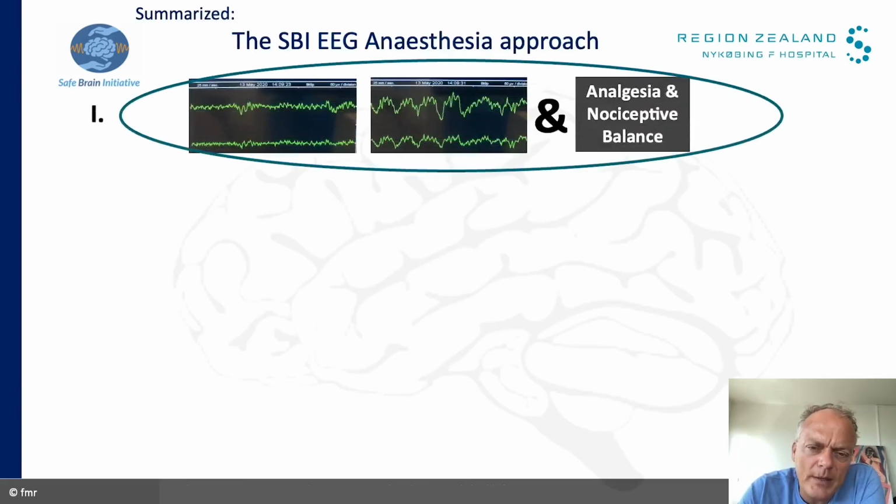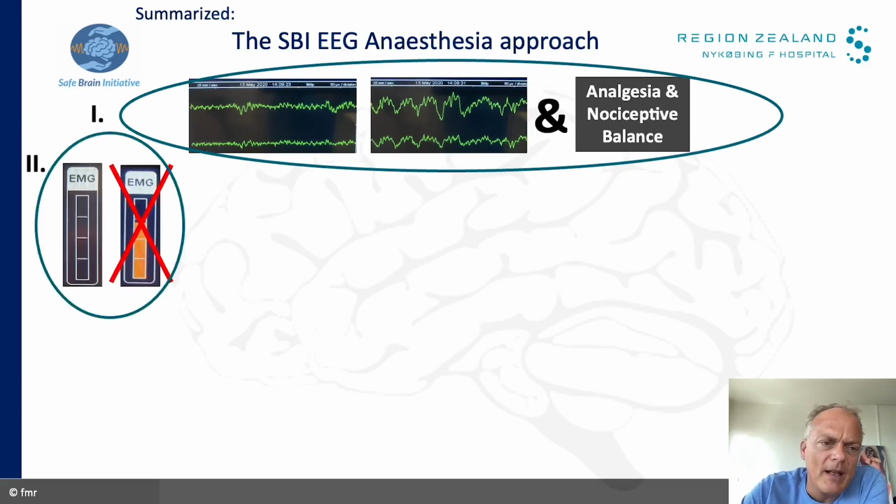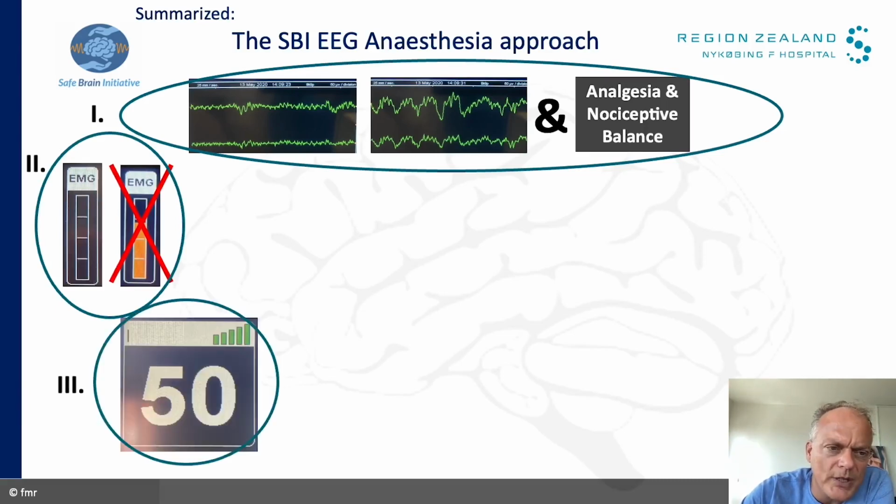And this is how we use EEG as well as processed EEG monitoring in our clinic. I always use the raw EEG under induction, to monitor the change from the beta-dominant rhythm to the typical delta-dominant rhythm with alpha waves on top of it. So I know this brain is adequately disconnected. Always make absolutely sure that your analgesic part is in place and your ANS control, so that the patient is pain-free, because intubation is obviously a very potent pain stimulus. Then do not cause too much noise, so you can also use the raw EEG.